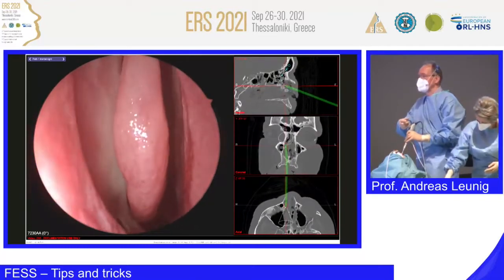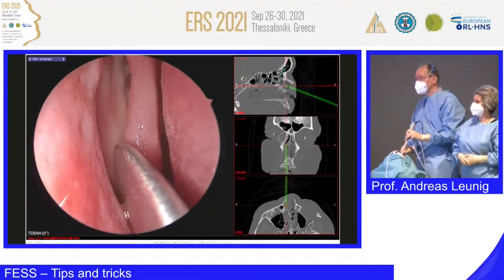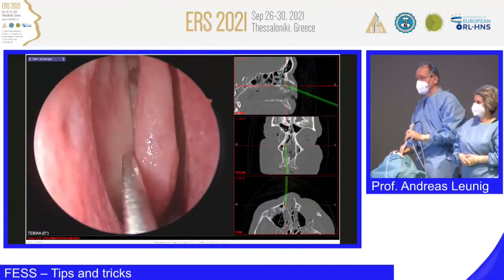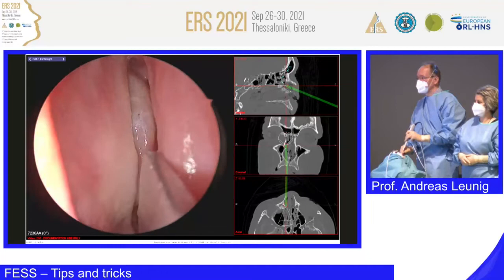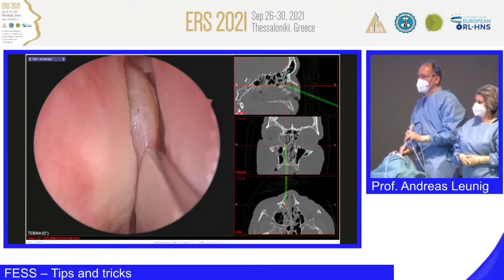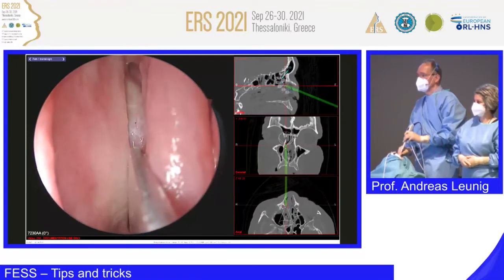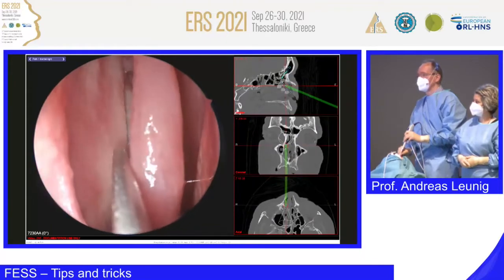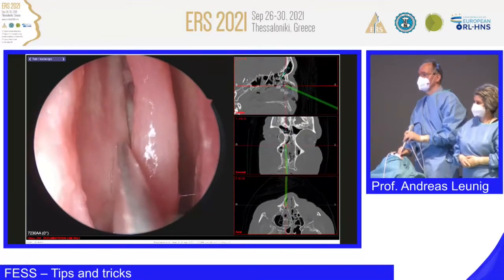I come back again a little bit now. Freya, please. Now I try to go in, and very slightly here to pull or push a little bit the middle turbinate, but please don't fracture the middle turbinate. And now what we are facing is the anterior wall of the ethmoidal bulla, as well as the free margin of the uncinate process. And what I usually do is, I try the flexibility of the uncinate process, which you can feel here, for later on to know where we can resect the uncinate process.